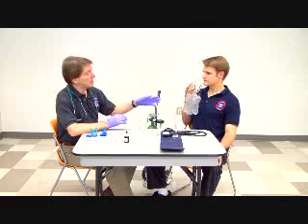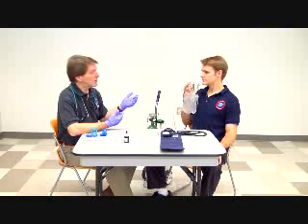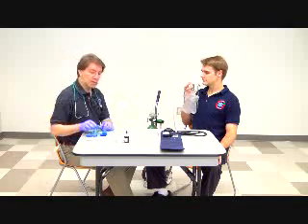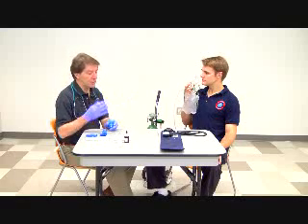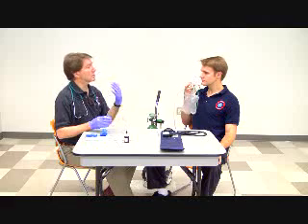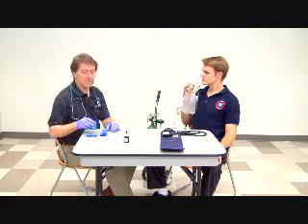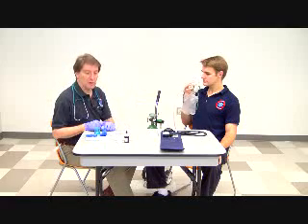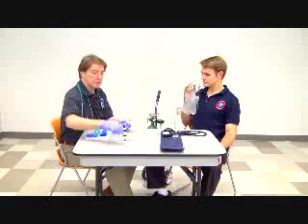All right, I'm going to reassure the patient. Sir, we're going to do everything we can to take care of you, and we're about to give you a nebulized medication treatment. And what that means is we're going to put some medicine in this bowl, run some oxygen or air through it, causing it to create a mist that you'll inhale and exhale slowly, and that will hopefully help your breathing. Okay? All right, I'm going to now assemble my equipment, and I'm going to begin by first checking my medications.